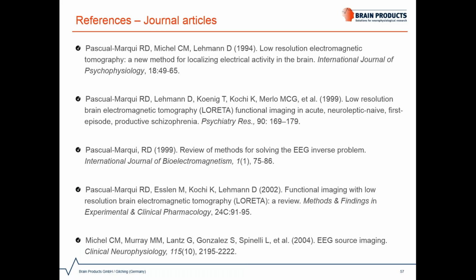In his other article published in the same year, you can also find a nice comparison of the inverse methods, where he compared the different source localization algorithms from the family of non-parametric approaches. Another nice article comparing and discussing all families of inverse methods can also be found in the paper of Christophe Michel, as I've mentioned in our question and answer session.